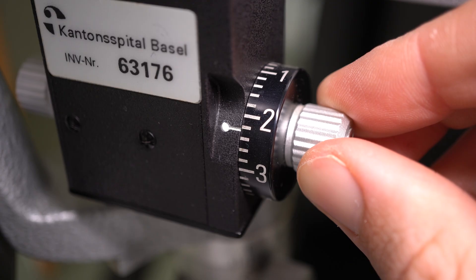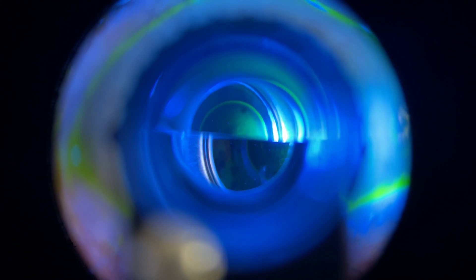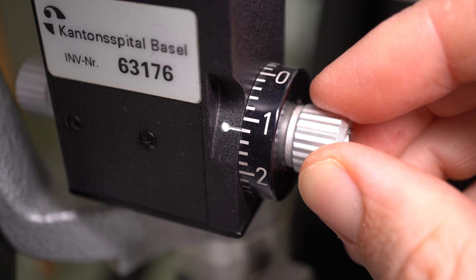Let's go through a couple of situations you might encounter. Situation one: your semi-circles are very small and far away from each other. This means the eye pressure is higher than what you set on the machine, so you need to set it higher — but please go off the cornea to do so. Situation two: the two semi-circles are very big and overlap each other. This means the pressure is lower than what you've set, so go off the cornea, move back a bit, and set the pressure down.